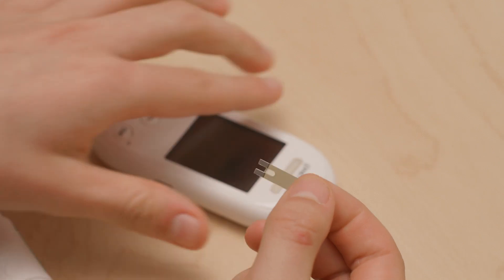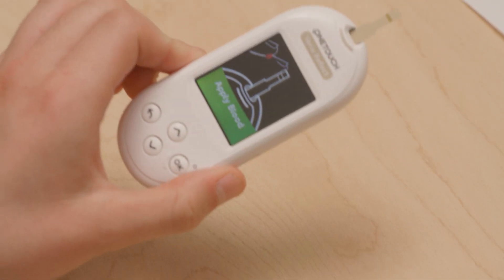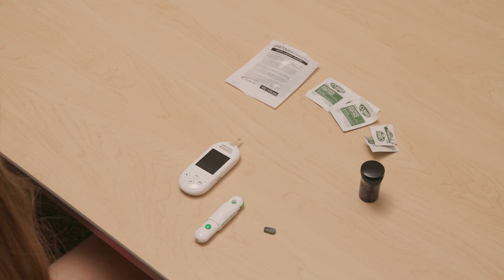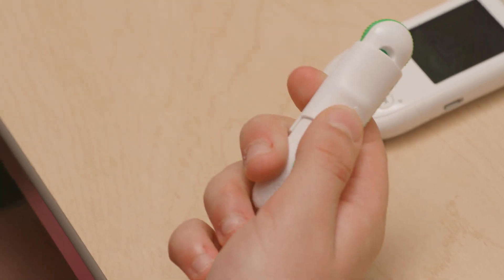Put the test strip in the meter — the forked end goes into the meter. Once the test strip is in, the meter will show that it is ready. You will touch the blood to the sideways line on the strip. Pull the middle sleeve of the lancing device back — this cocks the needle, getting it ready to poke.